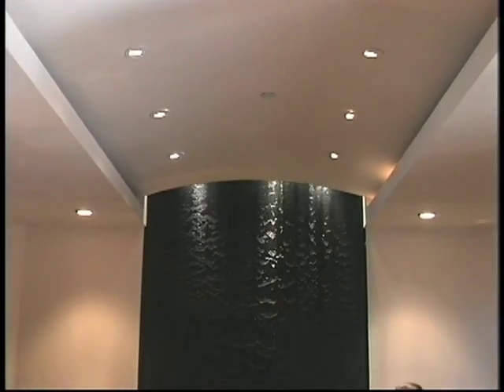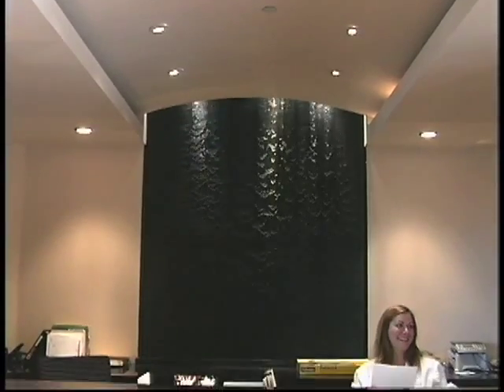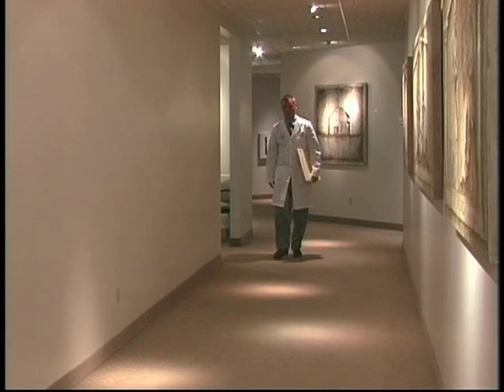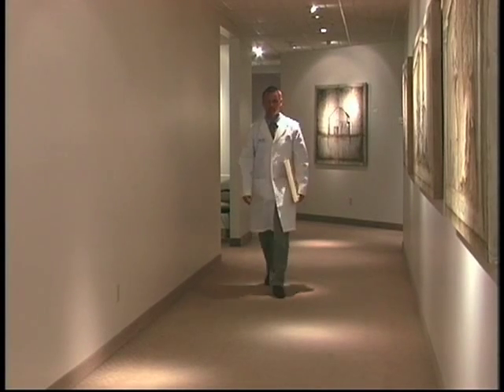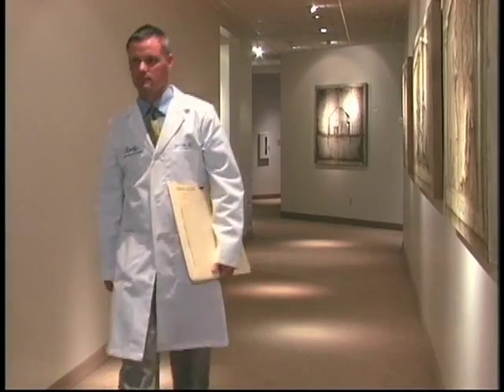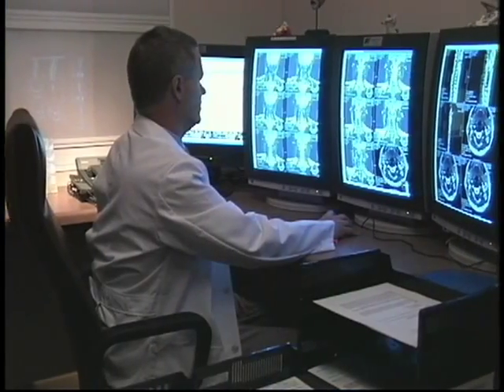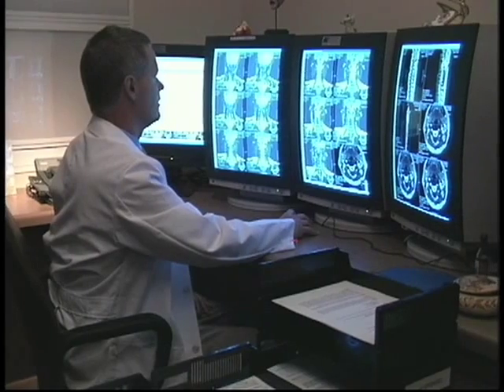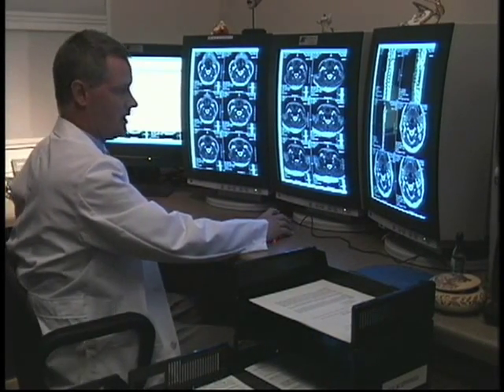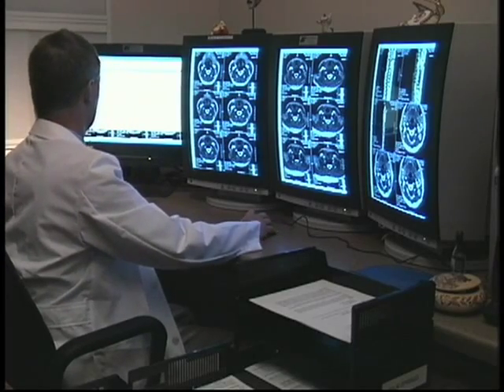These 3 offices are connected electronically. We use dedicated T1 lines so that we can transmit the images from each of these MRI units and CAT scanners to the radiologist that's the specialist in the particular area that the exam deals with. For example, I'm usually in the Indian Wells office, but any of the orthopedic MRIs that are done in Indio or in Palm Springs are also transmitted here, and I read them on a centralized computer system that's called a PACS system.